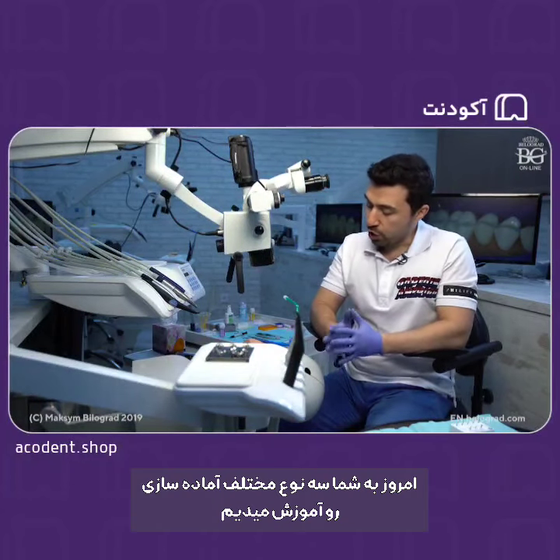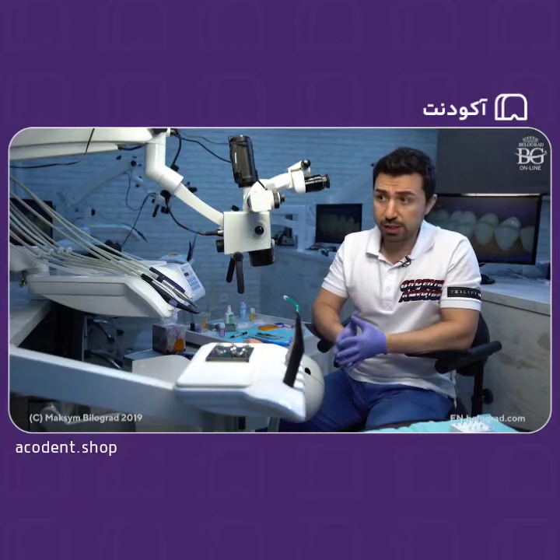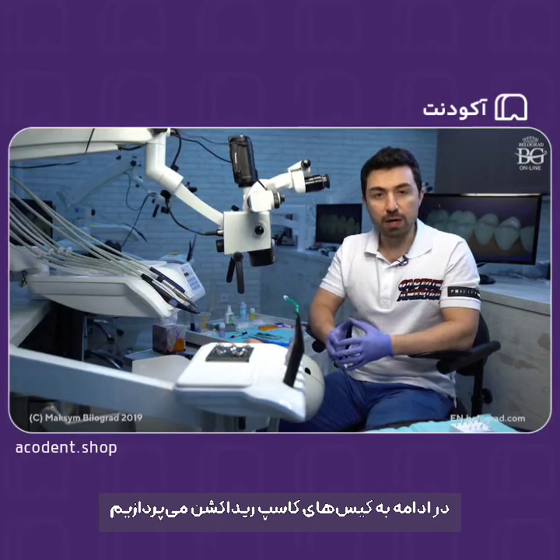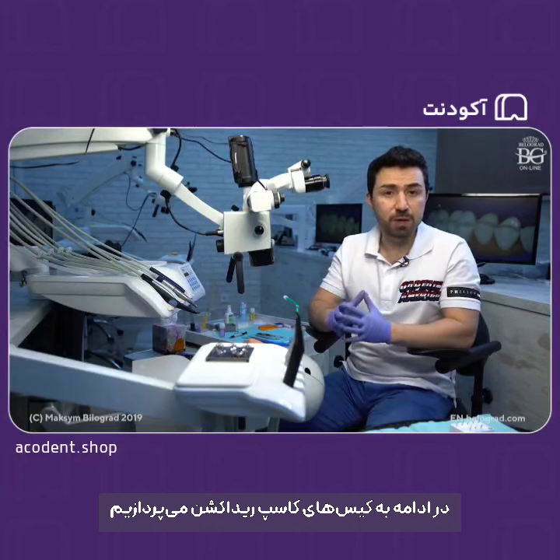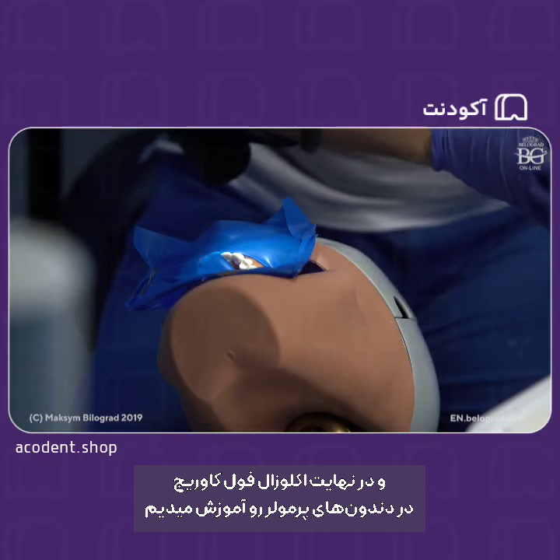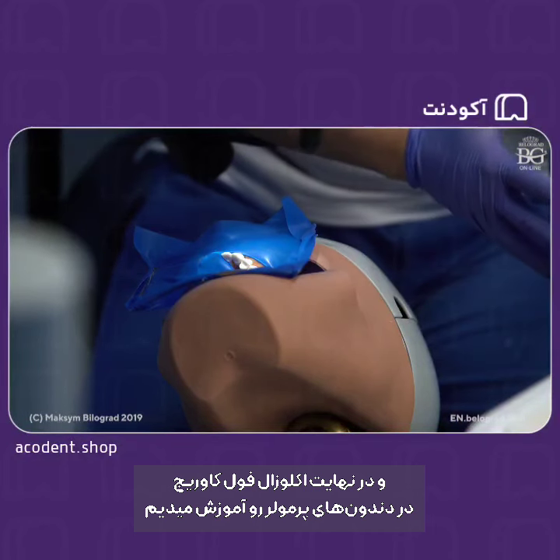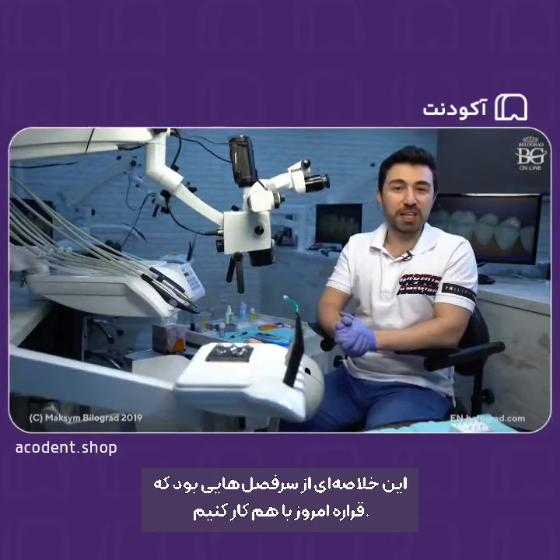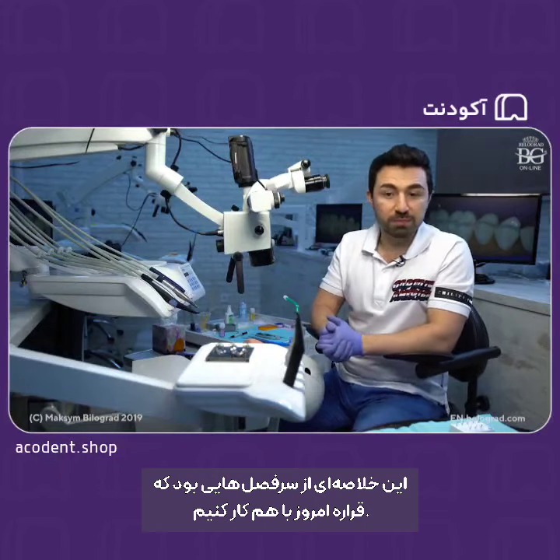We are ready to show you three different types of preparations. We'll do type 1, which is window prep. We will do a cusp reduction case, and we will do full occlusal coverage with a veneering of a premolar tooth. This is the sequence and this is the program for today.